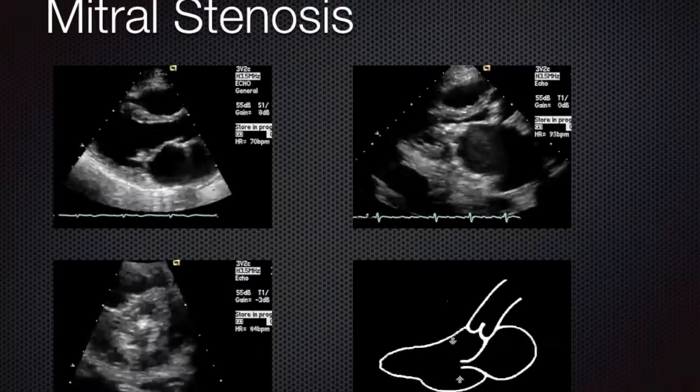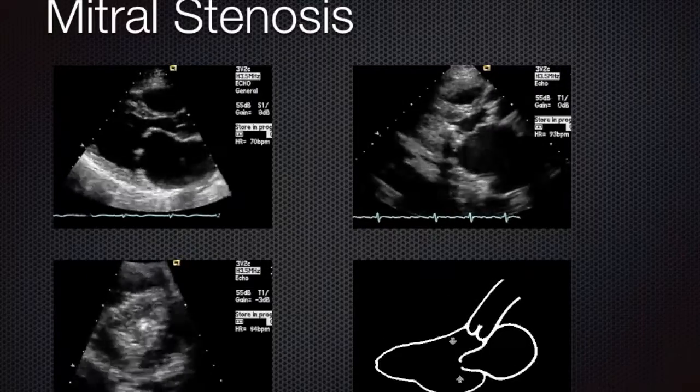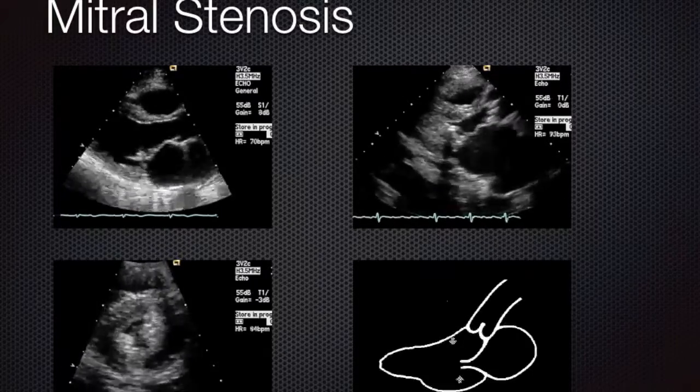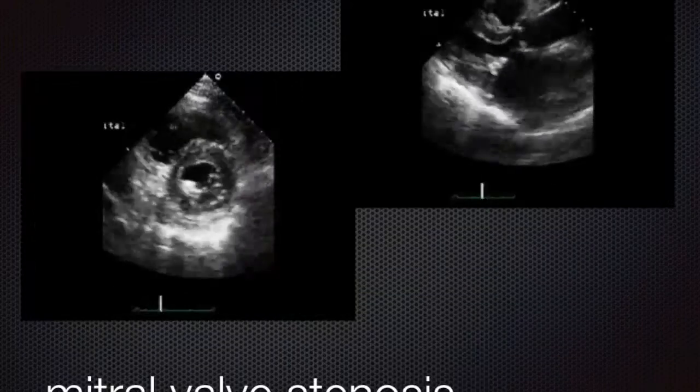So often you don't have to do any measurements, you just have to look and you can see that there's something wrong with the valve. It just doesn't look right. So let's have a look at some more pictures.